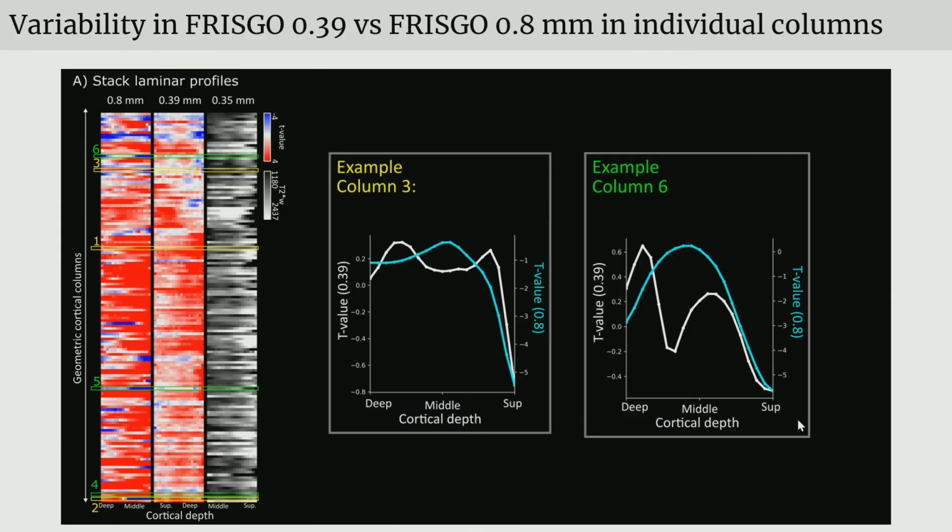Okay, I also would like to point attention to another type of profile, which I found very interesting. This is the opposite of before. Now we have a strong decrease towards the surface. And there are many profiles like this across all subjects. So where is it coming from?